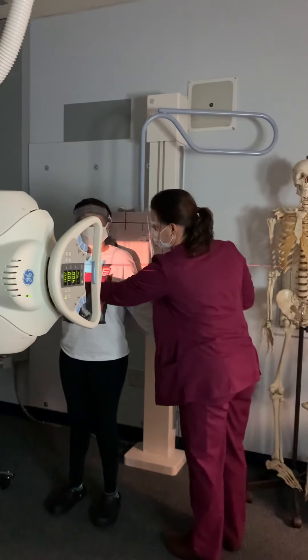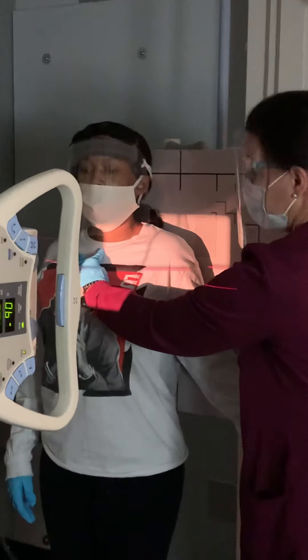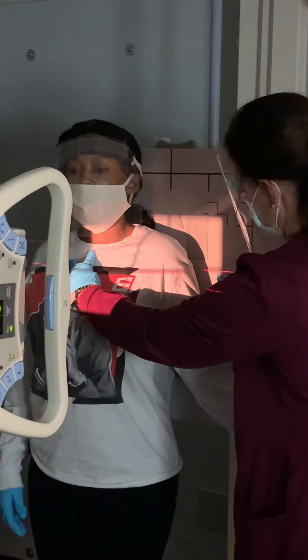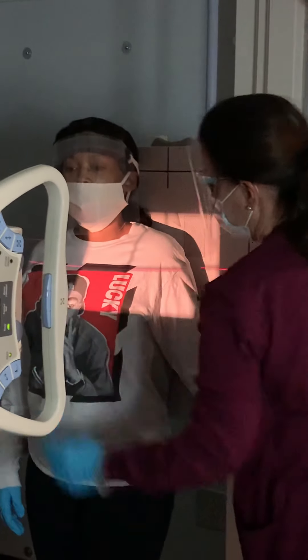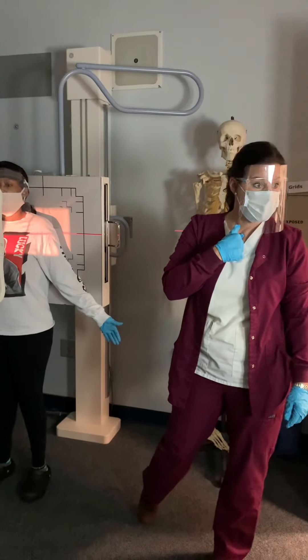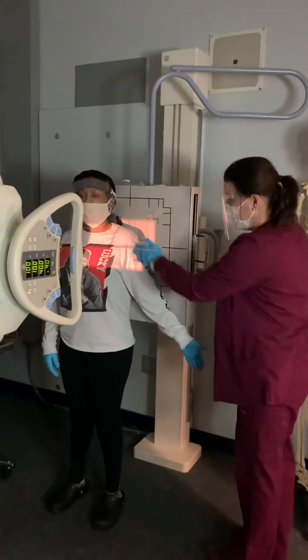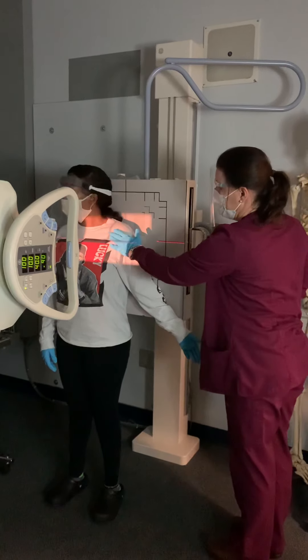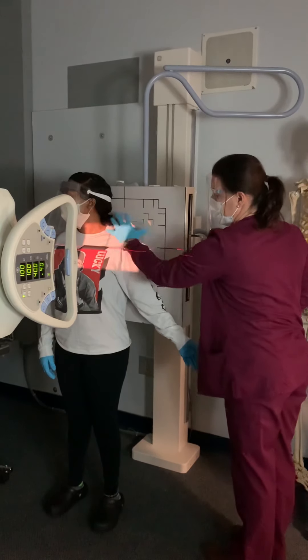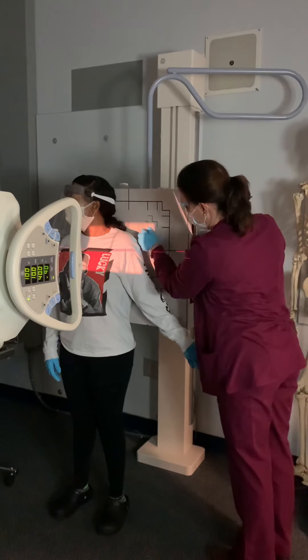I've got to make sure I've got her clavicle, so I'm feeling for her jugular notch, making sure I'm including it. I'm going to slide her over just a hair — got the jugular notch, so I know I have the medial end of her clavicle. Her hand is supine. I'm going to get you to turn your head away from me, make sure there's nothing in the field of view. I'm going to put my left marker on here.